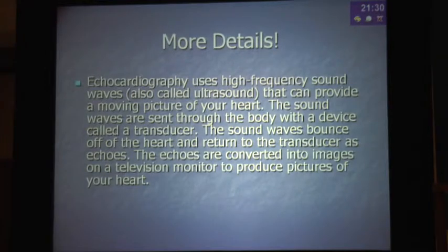Well, how does echo work? This is basically physics here. It uses high-frequency sound waves, also called ultrasound, that can provide a moving picture. That's what's different in an echocardiogram compared to an ultrasound abdomen, because it's moving structures here. A moving picture of your heart. The sound waves are sent to the body with a device called a transducer, which we put on the chest wall, and the sound waves bounce off the heart and return to the transducer as echoes. These echoes are converted into images on the television set, which we visualize.